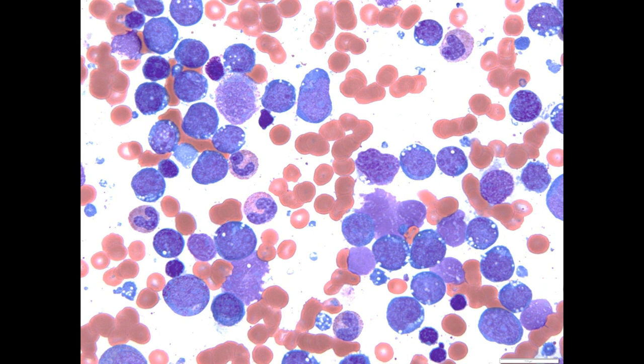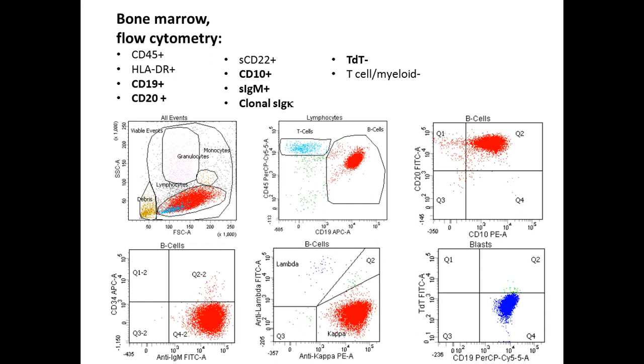These intermediate-sized basophilic blasts with this sort of cornflower blue cytoplasm and vacuoles that represent fat located within the cells. The nucleus is typically relatively round. There are multiple nucleoli that are peripherally placed, and the chromatin is not often particularly immature looking. It's more mature appearing, coarser, that is to say.